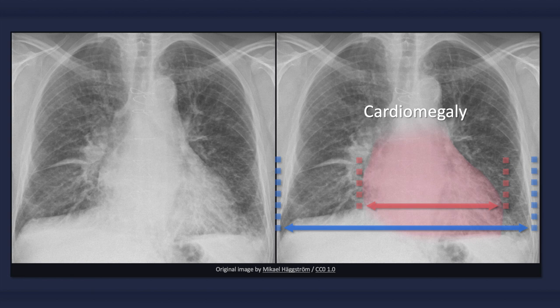In this image, the cardiothoracic ratio is approximately 0.6. You should also be aware that on anterior-posterior films, determination of heart size is unreliable due to magnification.